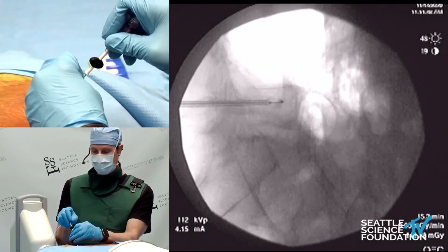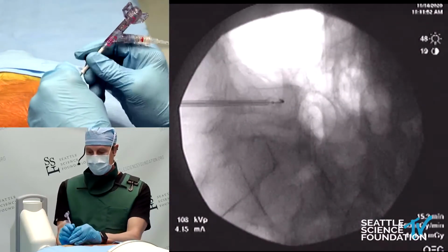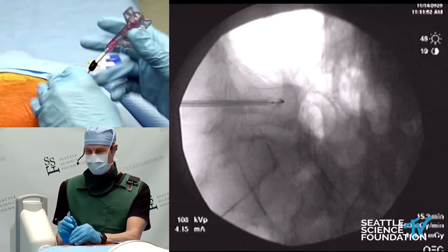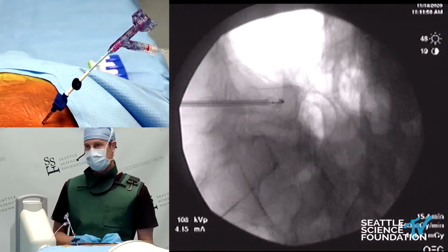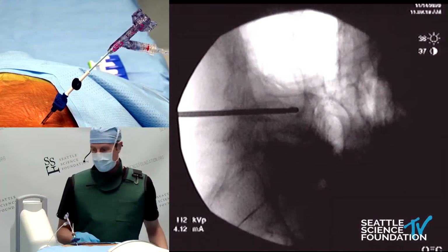And what we'll see is as we push this in, it's going to be located exactly the same location as the power curve. So that's nice right there. Let's go ahead and take an AP shot to confirm, and then we'll inflate.